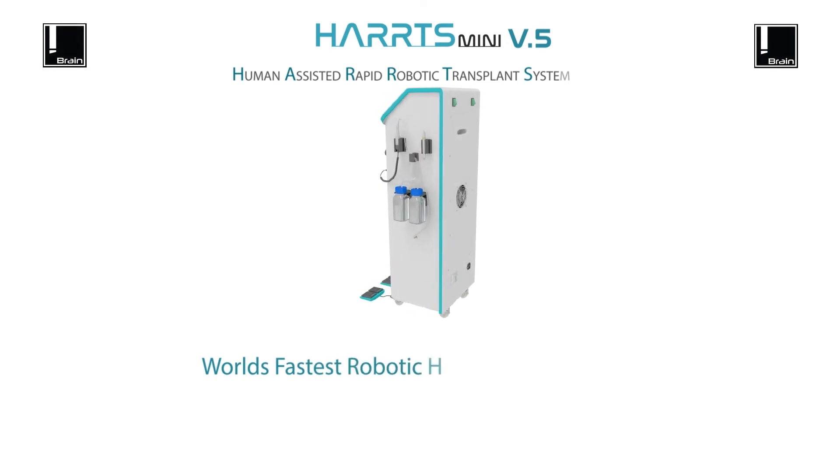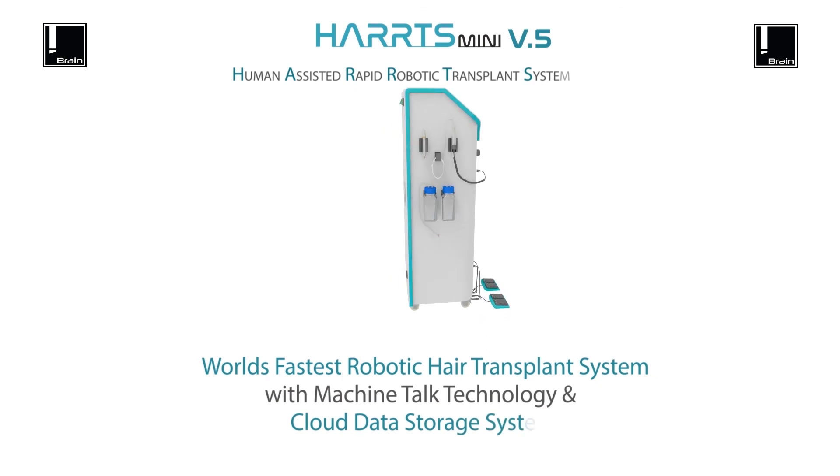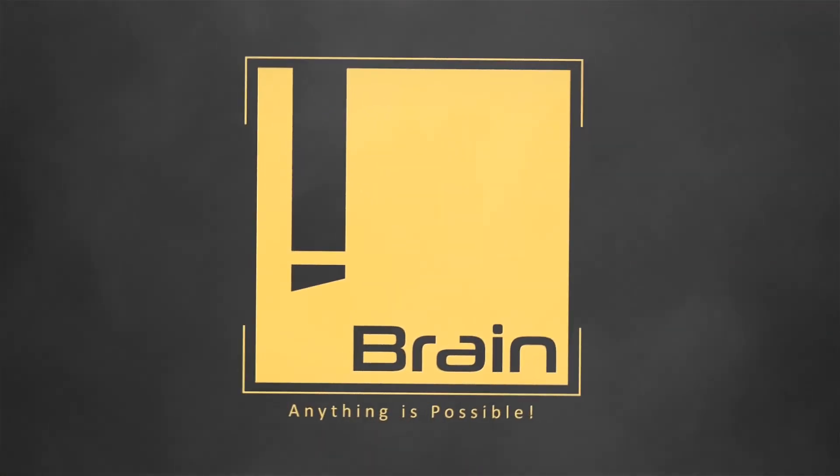World's fastest robotic hair transplant system with Machine Talk technology and cloud data storage system. Thank you.